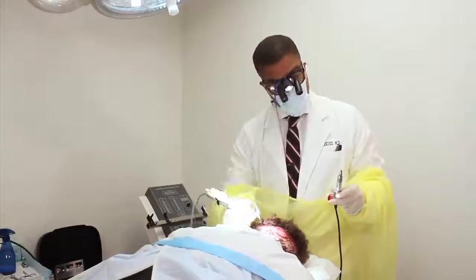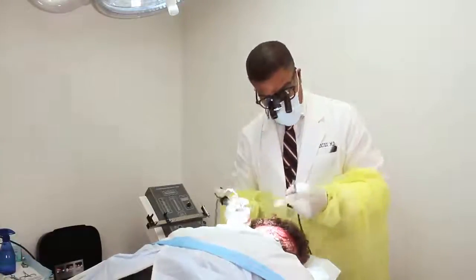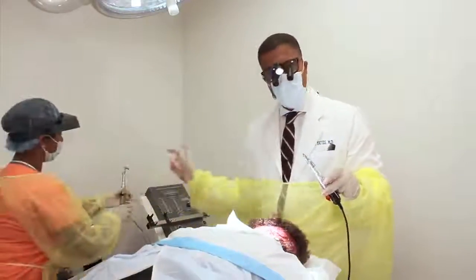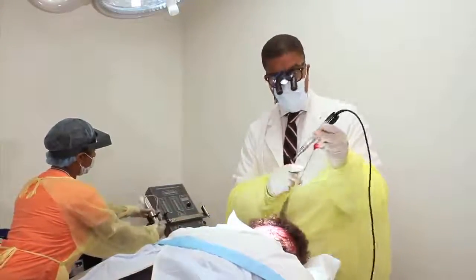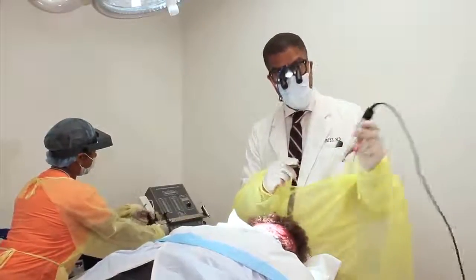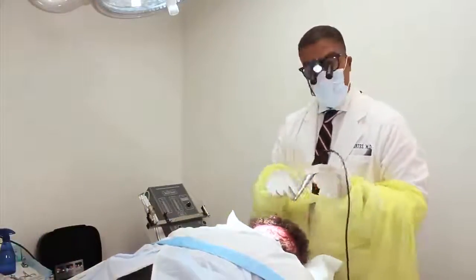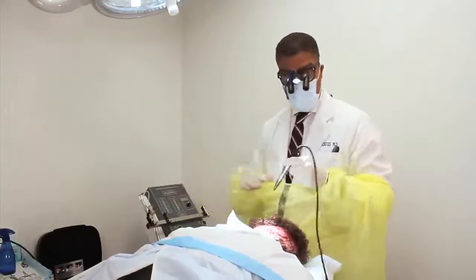The ARTAS is automated — I'm standing there controlling it, and the ARTAS is doing the work. The Neograph is controlled by my hand and my eye, just like the Harris Safe System or the cold punch. There's no such thing as a 'Neograph procedure,' just as there's no 'Harris procedure' or really an 'ARTAS procedure.' All of those are instruments used to harvest the hair. Neograph has done a great job of letting people know about FUE surgery.